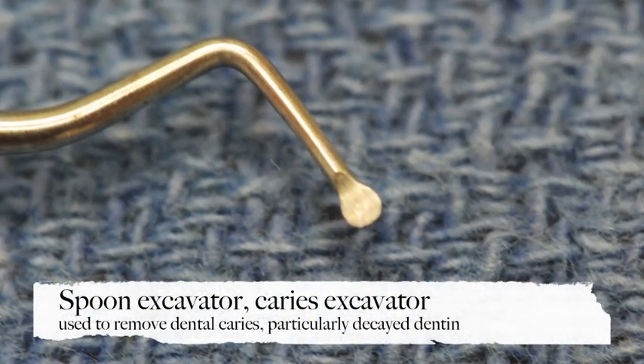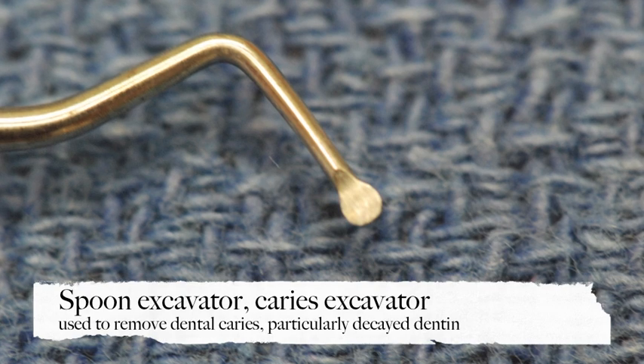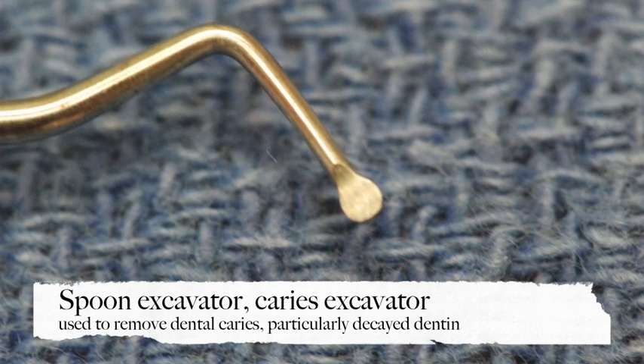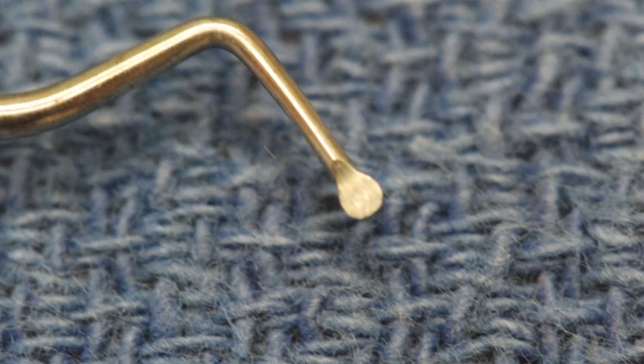This is a spoon excavator, also called a caries excavator. It's a sharp, rounded, double-ended instrument used to remove soft and decayed dentin from within a tooth.